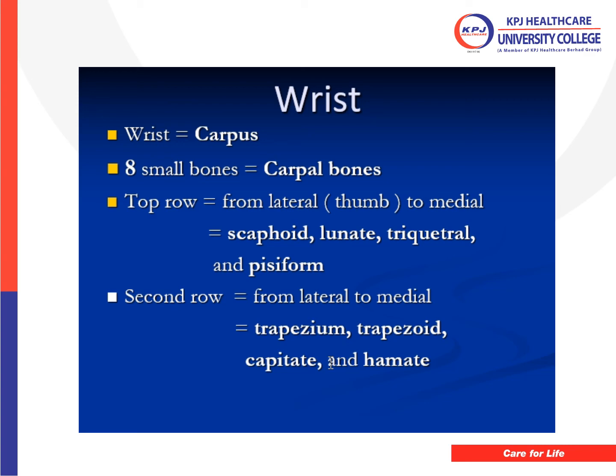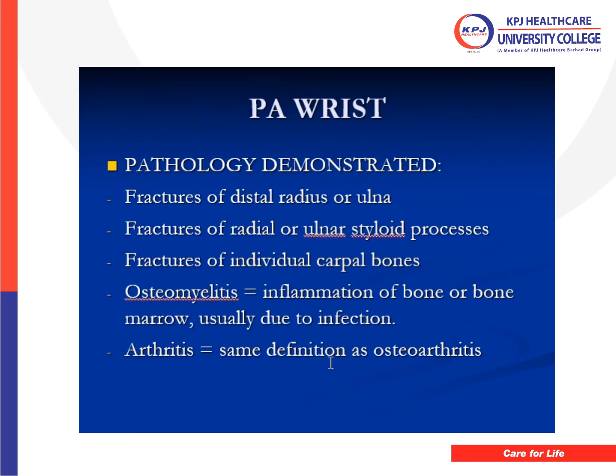For learning more details about these bones specifically, because the wrist is the one we usually fracture, there are specific projections that we will learn in IS2 next semester. So for the wrist, the basic projections are PA and lateral, posterior anterior and lateral.